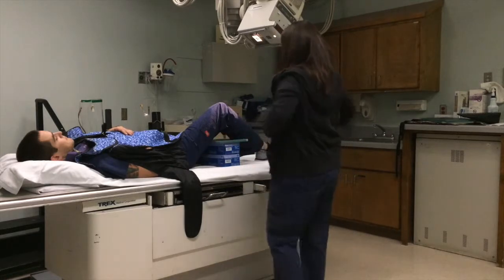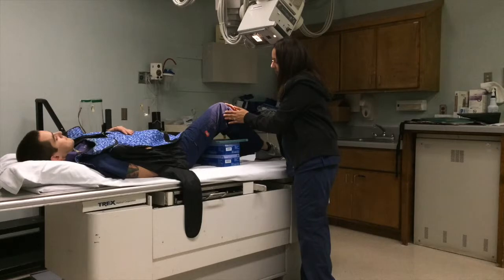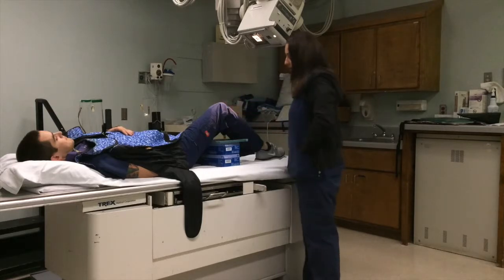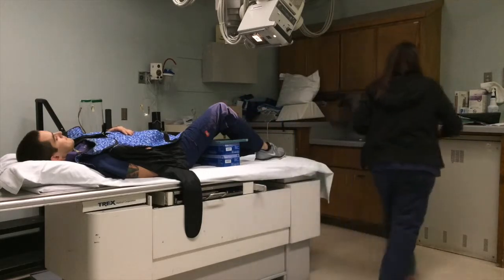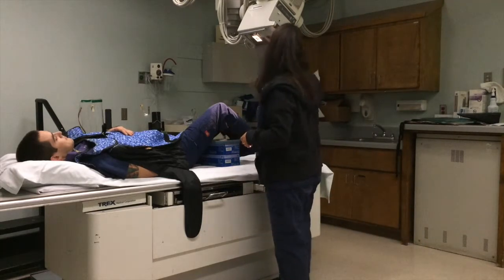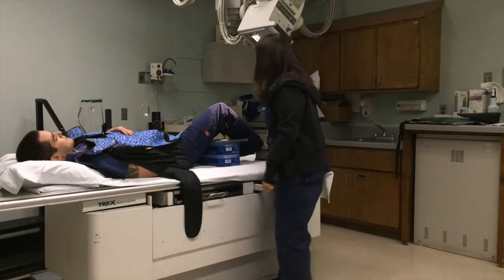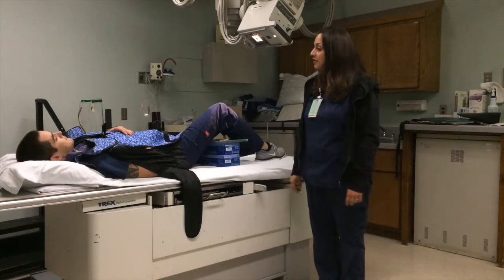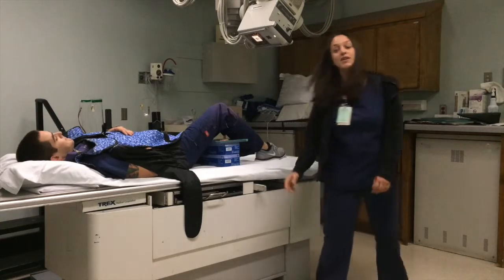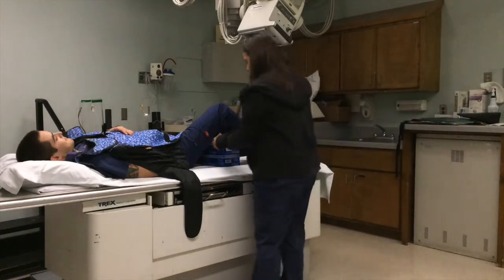Looks good. All right, so I have all the anatomy. I'm centered below the apex of the patella and between the epicondyles. I'm going to grab my right marker and put it on his right lateral side. I'll increase my collimation to make sure I include my marker, but not so much that I'm overexposing. And I'm going to shoot that film at 70 at 4. Please hold still. Okay, I like that image.